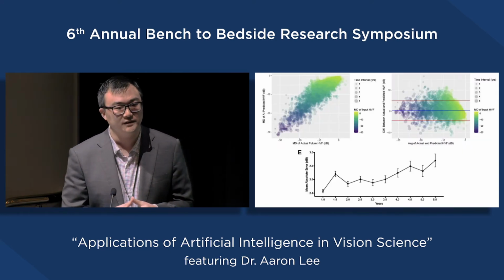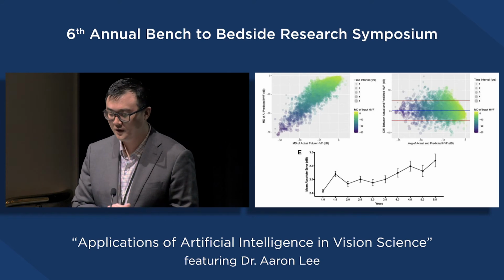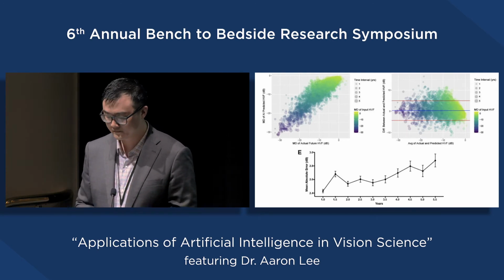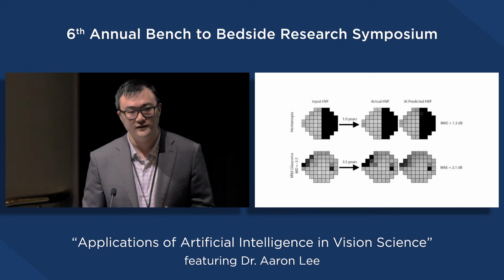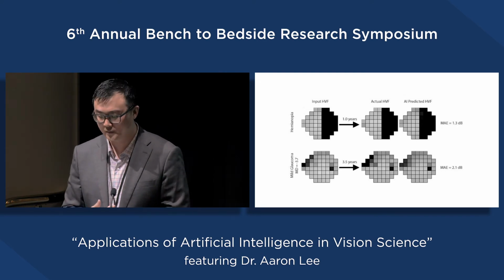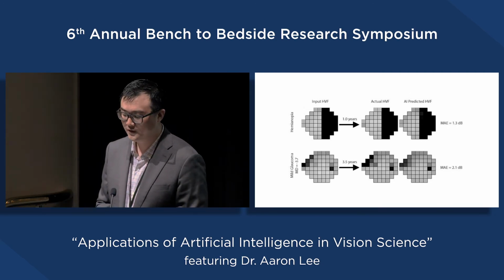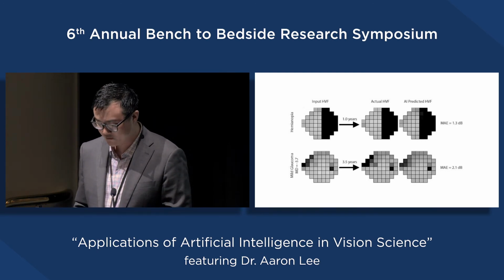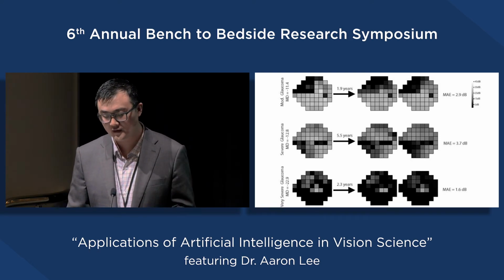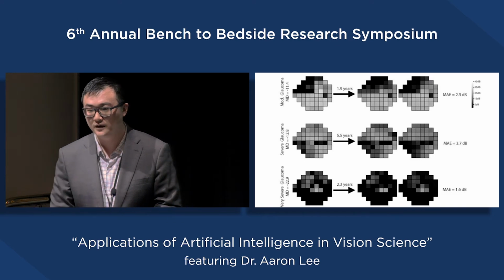And what was kind of remarkable to see was that the model could actually predict what that visual field was going to look like up to about 5 years into the future. All it had as input was the current visual field and the age and gender of that patient and nothing else. So, one of the things that we used as a negative control were neurologic fields. We wanted to make sure that the network did not predict that those were going to progress. And it's nice to see that it doesn't get confused in thinking that a neurologic field is a glaucoma field. What's really remarkable is to see how well it does in different severities of glaucoma at different time points. So here, what you're seeing on the left-hand side is the current visual field. The middle is what actually happened at that time interval later, and on the right-hand side is the AI prediction.